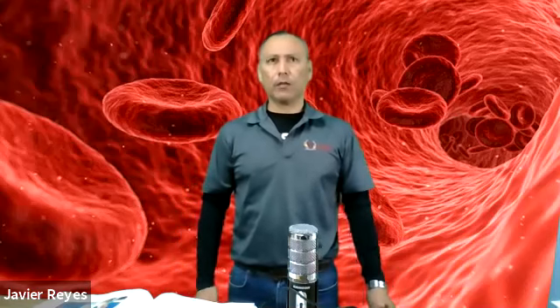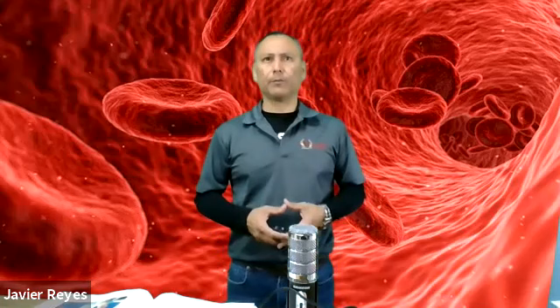Neonatal bilirubin, that's another very common newborn screening. We'll look at how to perform a newborn screening test and tests that cannot be performed on capillary specimens. As we said earlier, specimens for capillary punctures are very limited in the amount of blood. Therefore, you cannot perform every single test on capillary blood. Some people don't understand that, but we'll explain why.